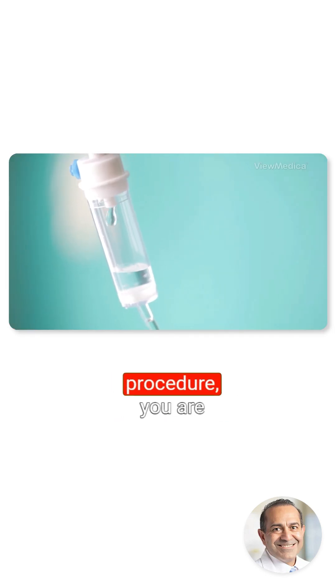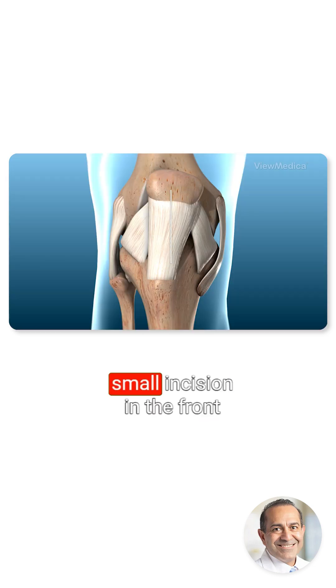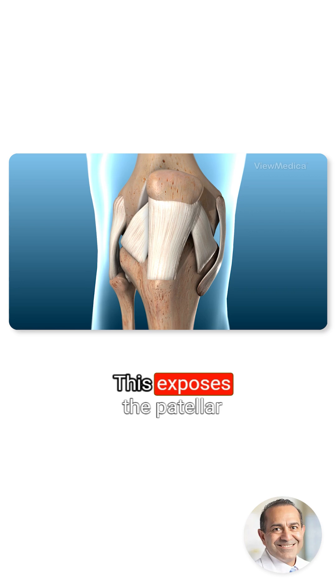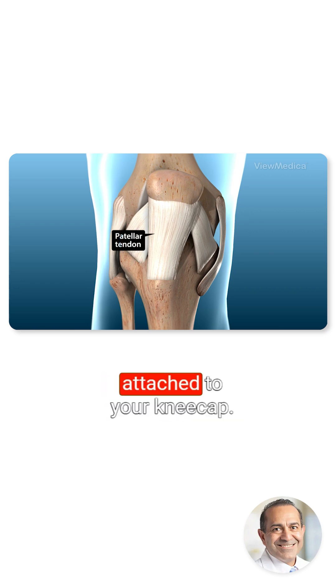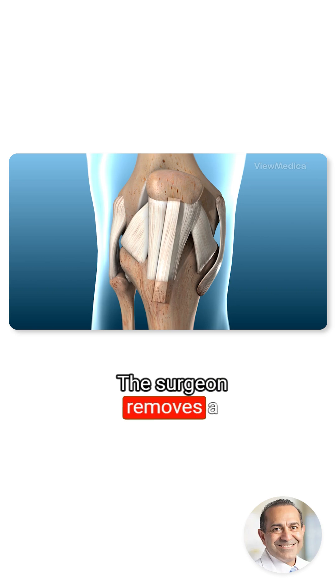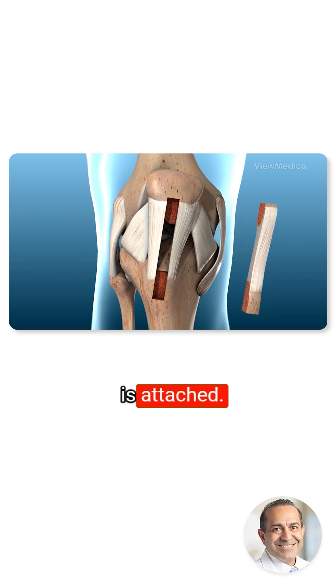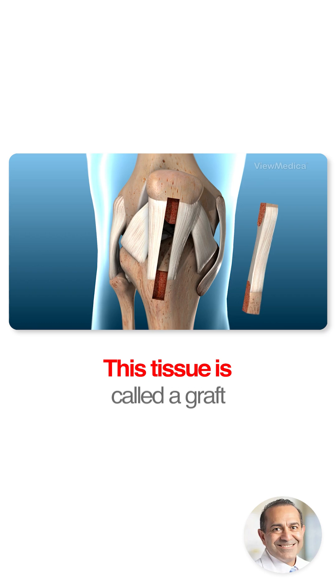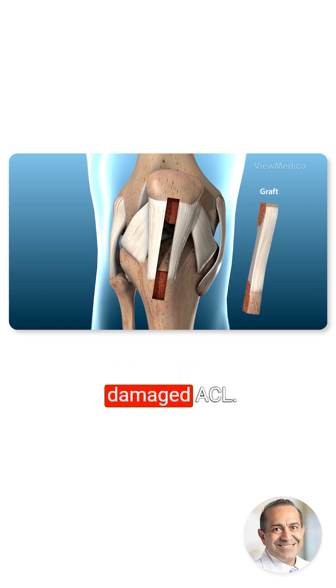In preparation for the procedure, you are anesthetized. The surgeon creates a small incision in the front of your knee. This exposes the patellar tendon, a thick band of tissue attached to your kneecap. The surgeon removes a portion of this tendon and some bone where it is attached. This tissue is called a graft. It will be used to replace your damaged ACL.